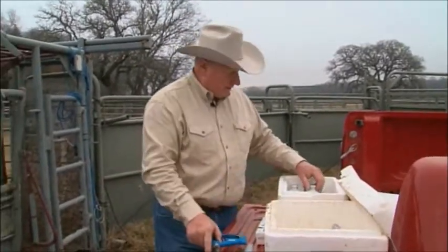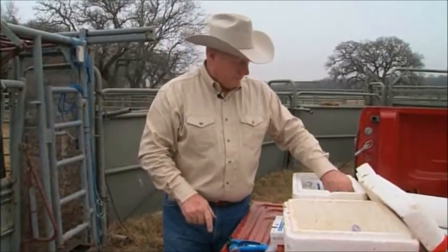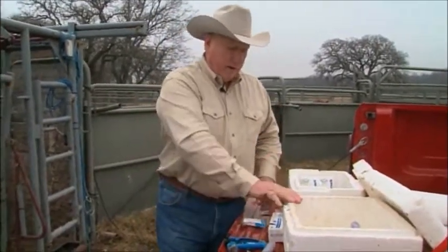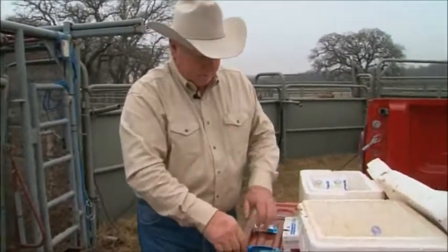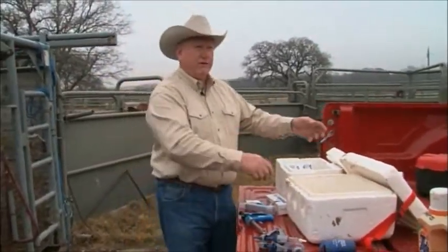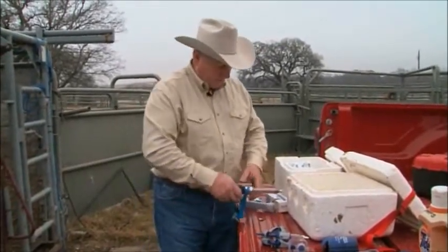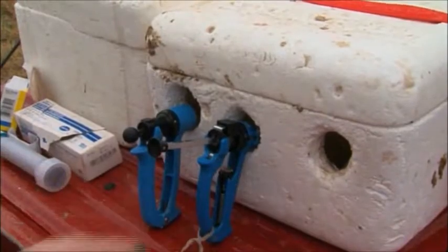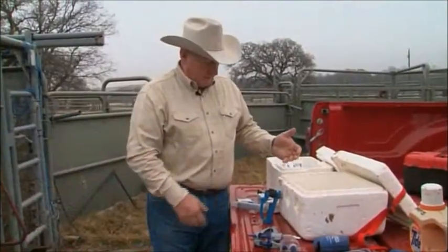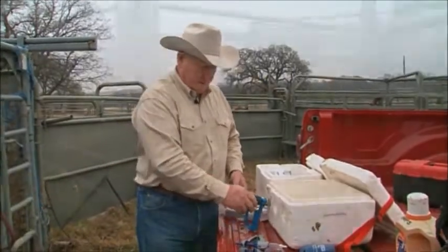Have your vaccine in what I'd call a storage cooler. This would be what I'd call a working cooler. I came up with this idea many years ago because I got tired of taking the lid off a cooler as I was trying to process cattle at the chute. Very simple. You just cut holes in the side of it and you can stick your syringe in it. That way it's readily available as you need to get your syringe and go process cattle.